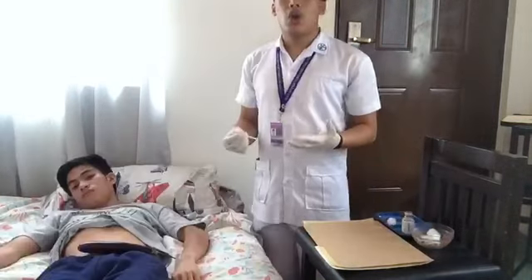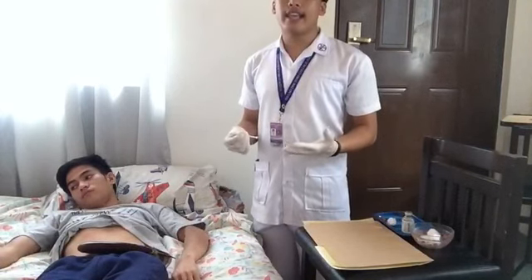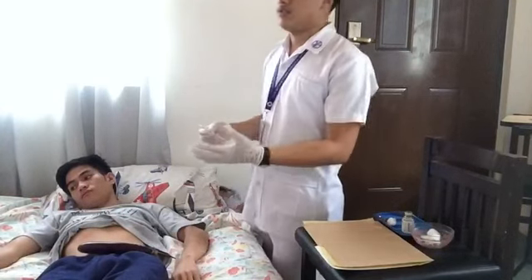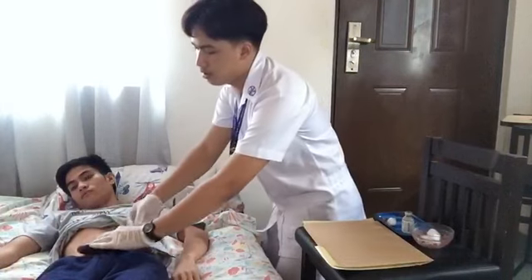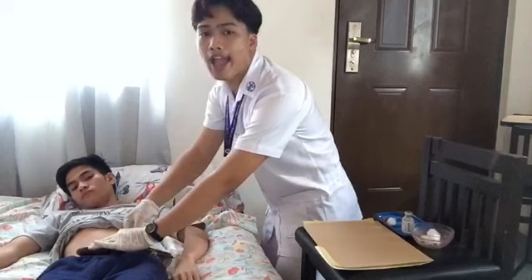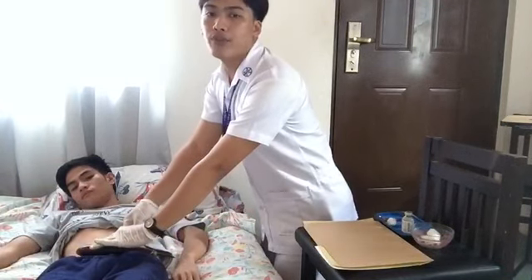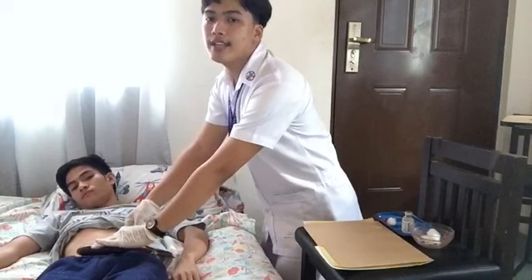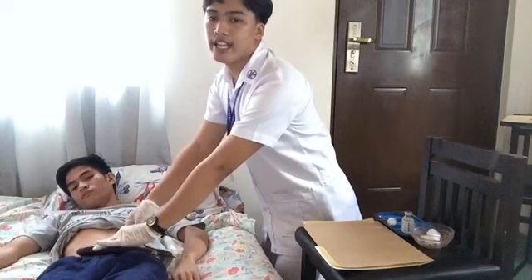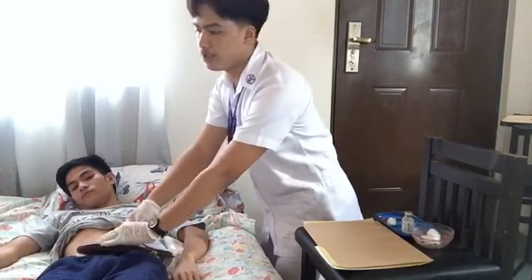So, next is apply clean gloves. So, next is using the non-dominant hand, pinch or spread the skin at the site and insert the needle using the dominant hand in a firm, steady push. So, I am going to pinch his abdomen. And when the needle is inserted, move your non-dominant hand to the end of the plunger. Some nurses find it easier to move the non-dominant hand to the barrel of the syringe and the dominant hand to the end of the plunger.